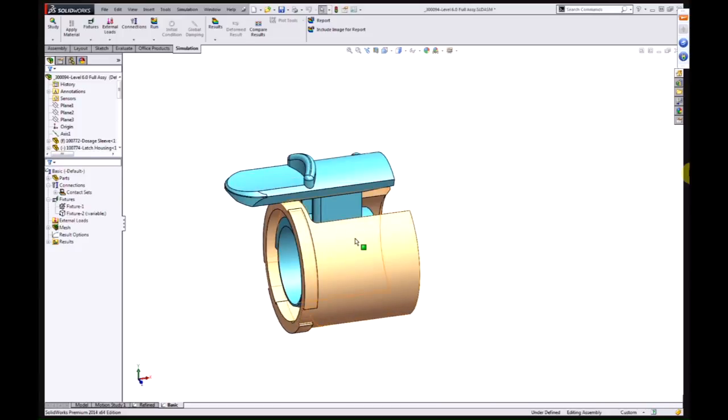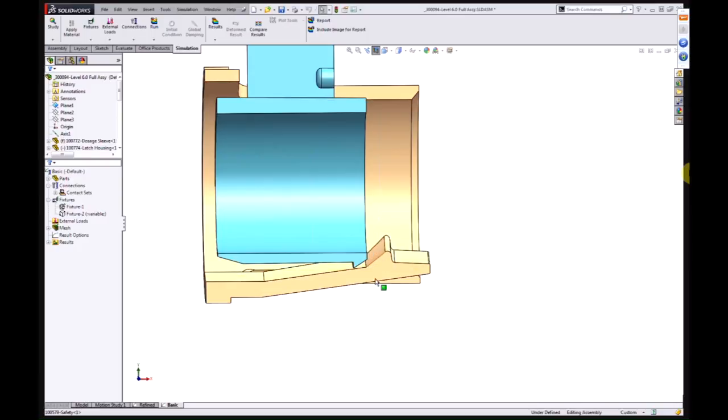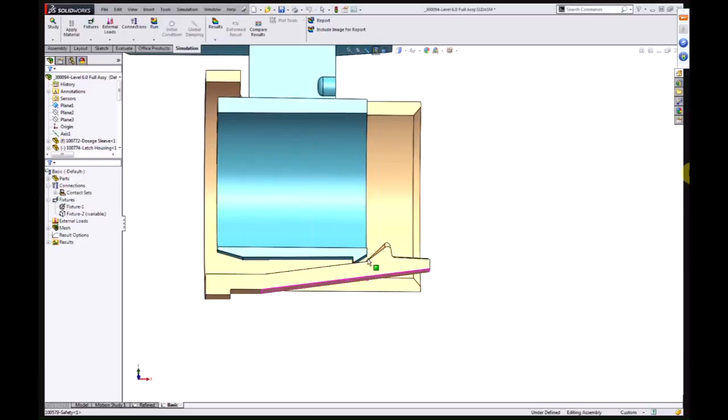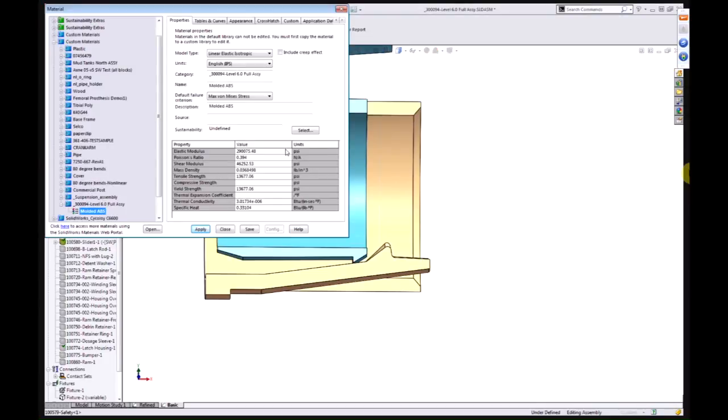But what we do have here is moving contact. We have this part transiting past the clip here, and that's going to cause a moving contact position, which we don't do well in a linear analysis. So in fact, this is going to be a nonlinear analysis. The setup of the nonlinear analysis is pretty straightforward. I've defined the material properties of the parts that I'm working with, and I'm using linear material assumptions here. So just the stiffness and Poisson's ratio are the main inputs that we'd utilize. We've got most of the parts excluded, so that's a nice function in SOLIDWORKS Simulation. You can have the whole assembly in place, but only consider 2 or 3 of the parts.